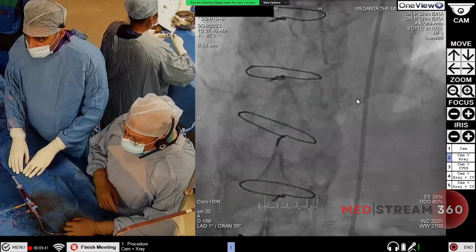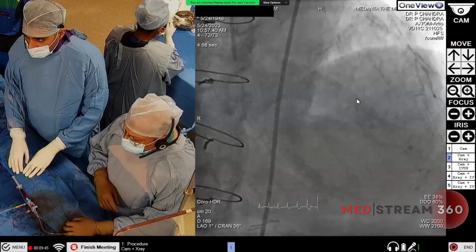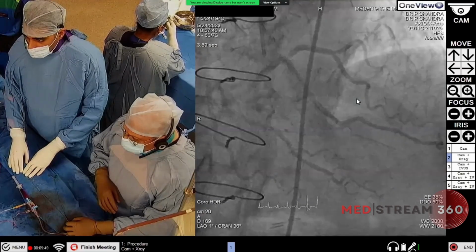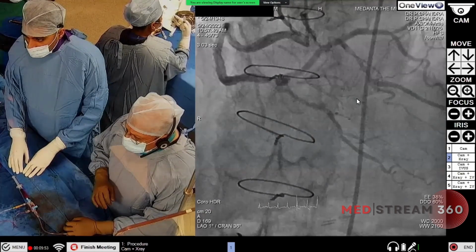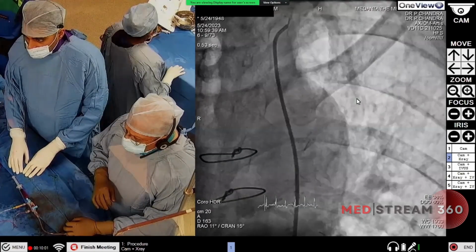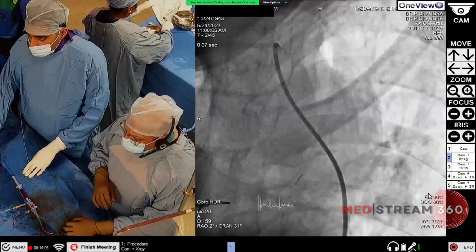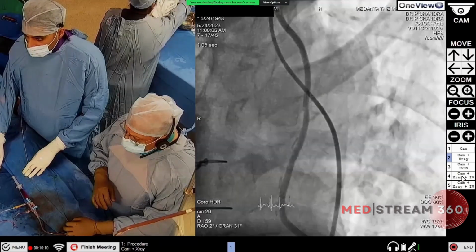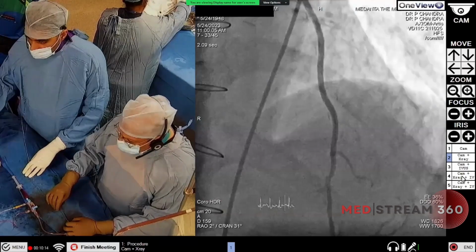So we checked the same artery in different view, and we see that the main vessel is going into the PLV distribution. PD is also reasonable, but has no major disease. And in here we see that the lima is flowing very nicely. The lima flow is very good, extremely nice, no issue of any stenosis, etc.